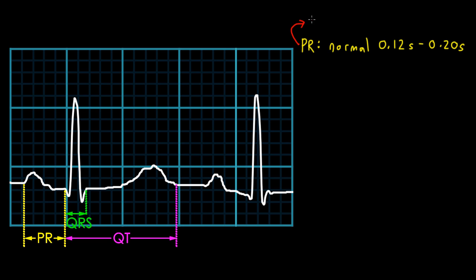A PR interval that's greater than 0.2 seconds is called prolonged. Most commonly this is due to increased AV conduction delay, such as what is seen in a first degree AV block. A first degree AV block represents a consistently prolonged PR interval.